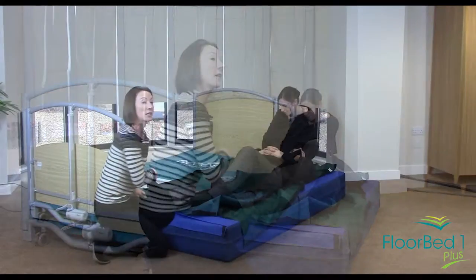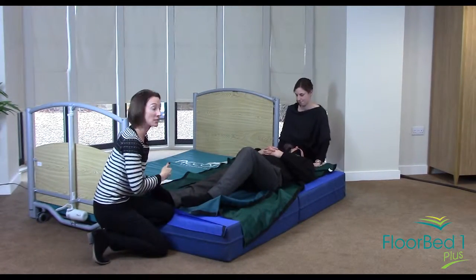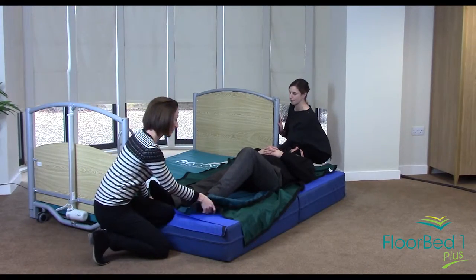Now we're demonstrating it this way as if there was a wall on the other side of the bed, which is often the case, so we're not going to use the access on the other side of the bed.